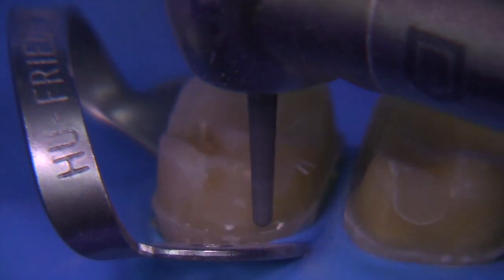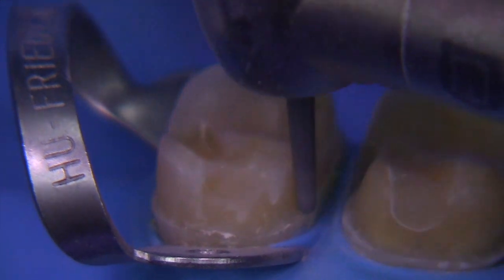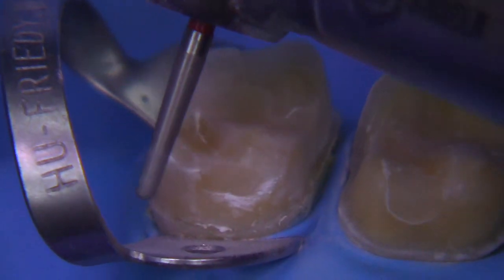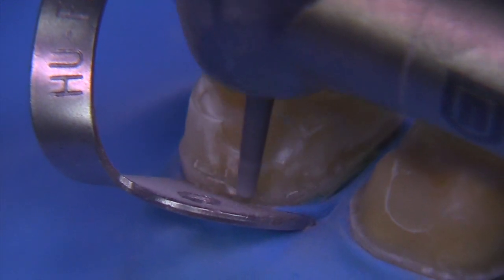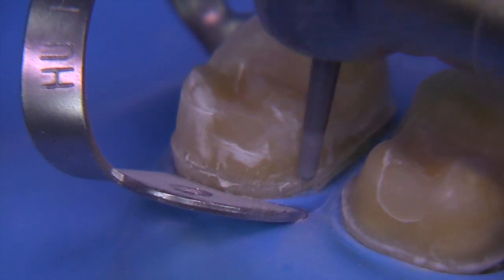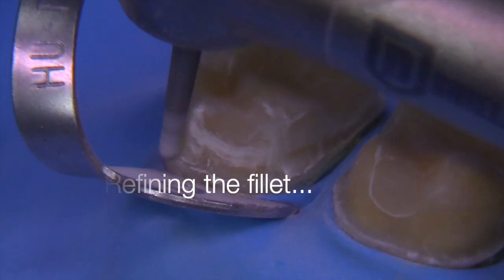This is the fine finishing burr that is a complement to the 856, and this is called the 8856. The diamond particles in this particular burr are only 30 microns in diameter average, so it makes for a much smoother surface. It's great to do this at a little bit lower speed. This is where I use my microscope — I'm not getting to use it here in this particular case, but I like to use the microscope for these types of finessing procedures.